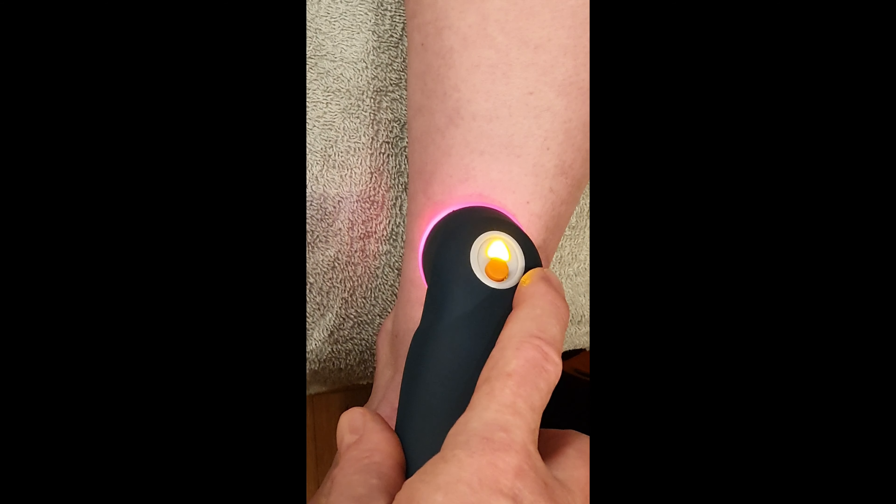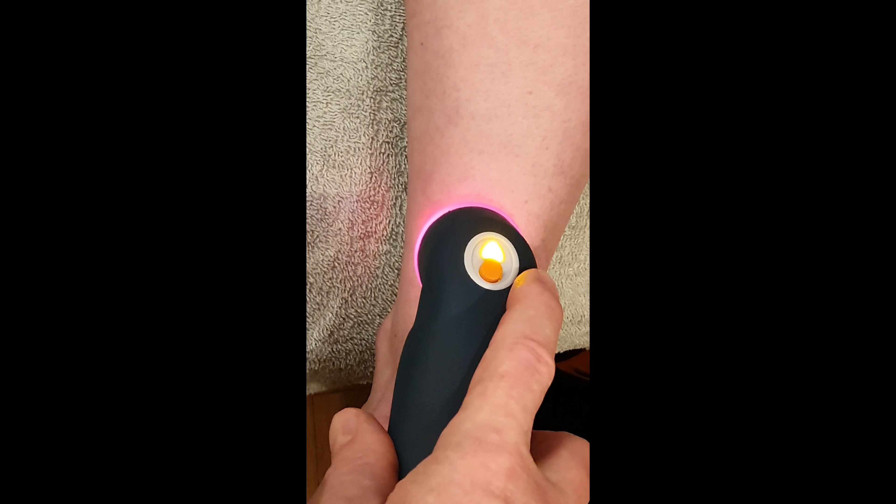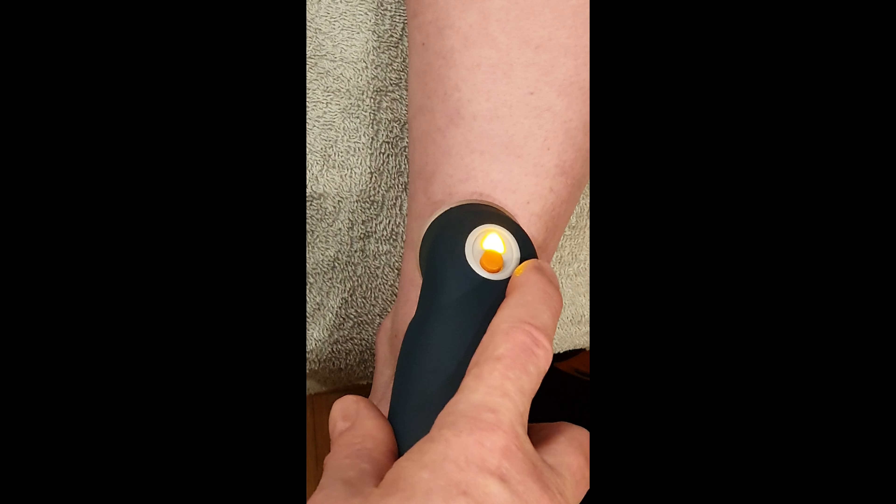Moving up for the final third spot. I'll fast forward just so we're not using up all the time. And that's the end of the treatment.